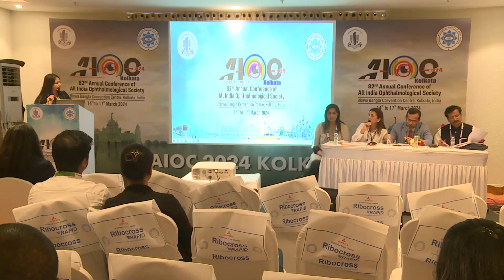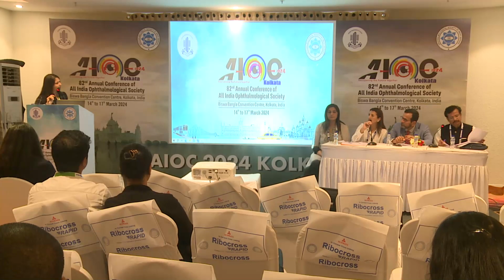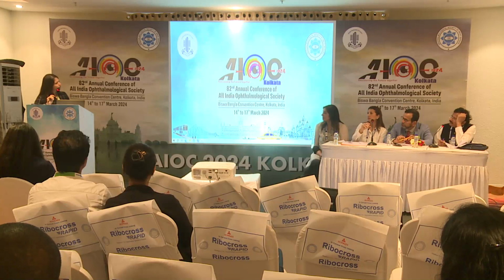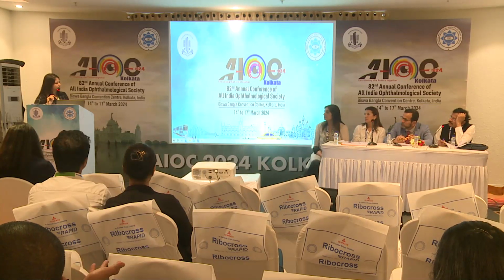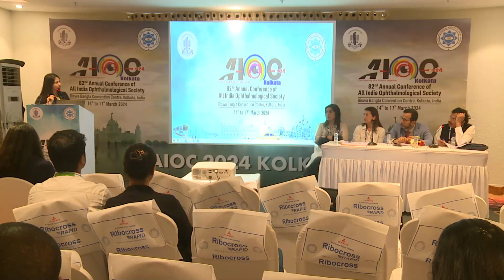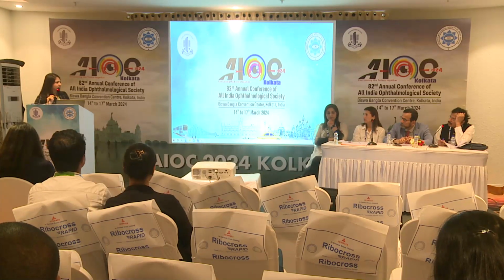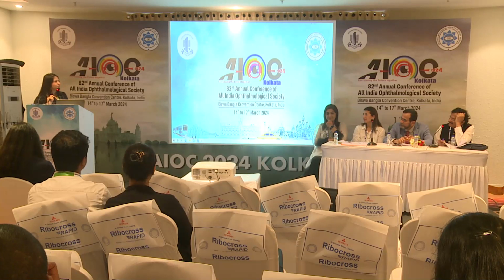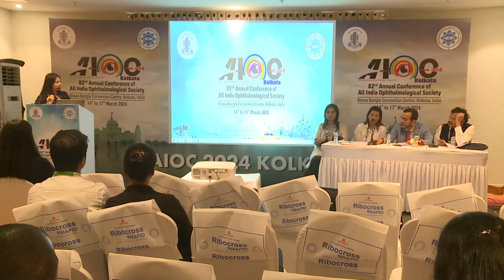But were these cases done after the learning curve or during the learning curve of using hydro implantation? During the learning curve. It was done by a single surgeon. Any complications you had in the hydro group? There was no complication or difficulty noted, sir. The hydro group is much easier, but not anybody can do it. Definitely you need to do some number of surgeries to get used to the implantation and how the ACD is maintained with the hydro or even with the visco, because it becomes a little tricky while implanting the lens.